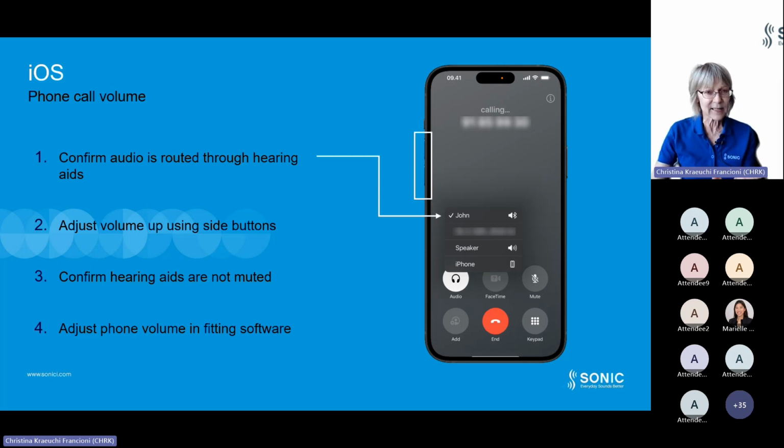There in the accessory menu, you have all the possibilities to fine-tune or personalize the sounds for smartphone, TV adapter and sound clip. I'm sure you already know this, but in case you do not remember, it is always worthwhile, if your client complains about too soft sound, to double check the software as well.